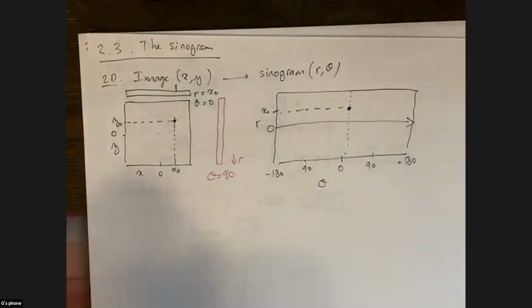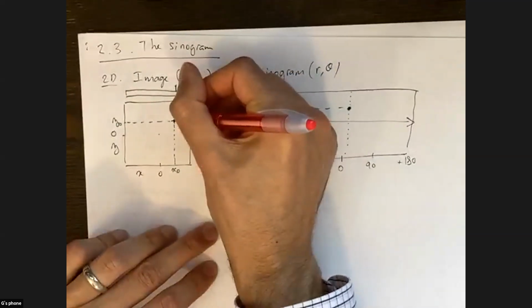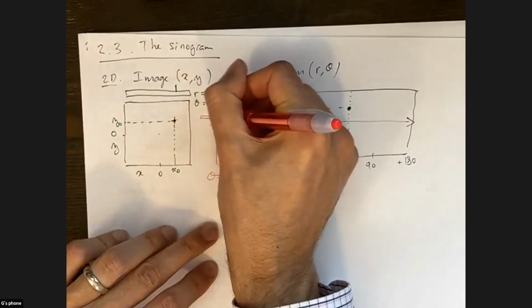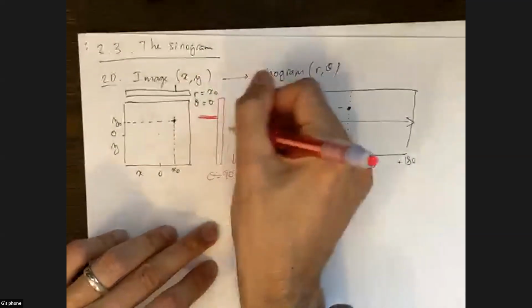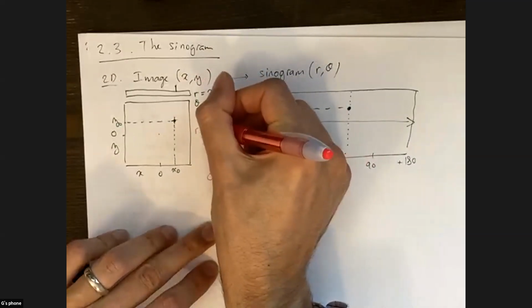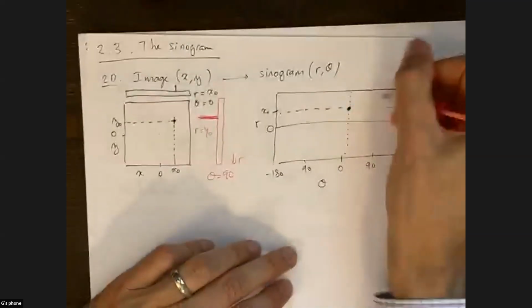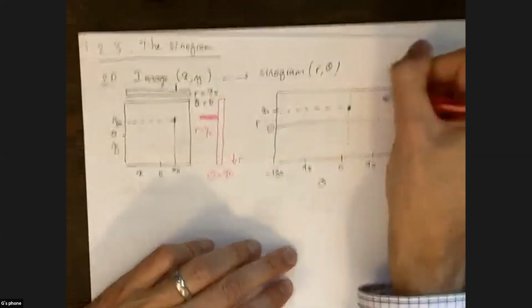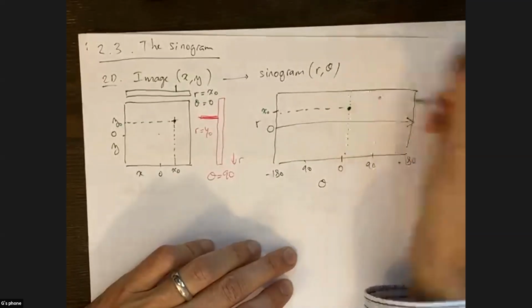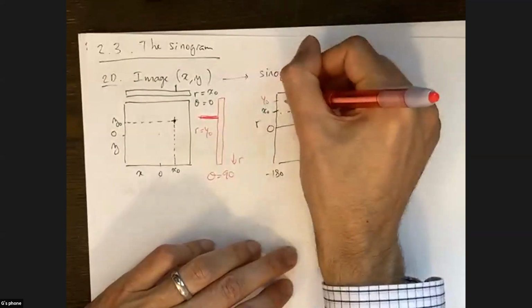So basically the point source is going to project on the gamma camera, and the only place where we measure counts is for R equal y0 this time, okay? So for 90 degree, this is the angle we're looking at, and the only place there's non-zero count is here, and this is going to be y0, okay?